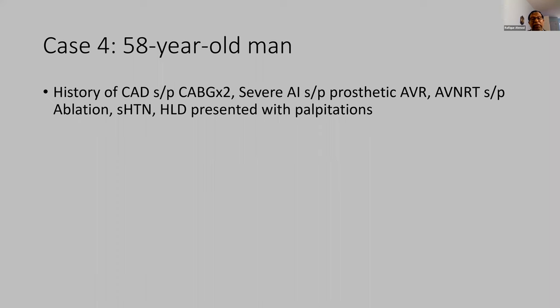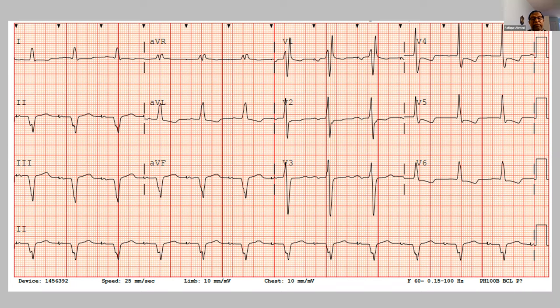the problem is that you will have to call it sinus node dysfunction with ventricle AV dissociation, complete heart block, because junctional. If it is junctional, then technically this is complete heart block. Well, no, not necessarily true. If you have isorhythmic AV dissociation, then it is dissociation. If you say AV dissociation, we are good. Yes, there is AV dissociation.